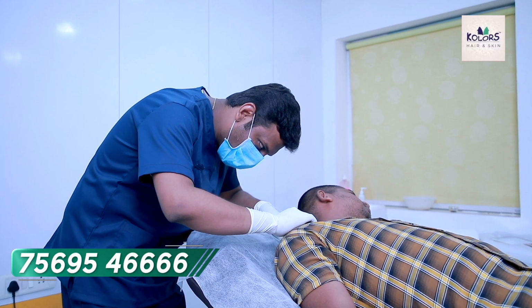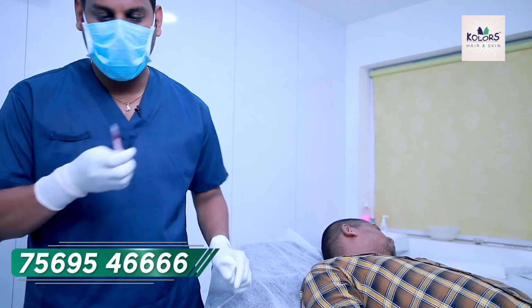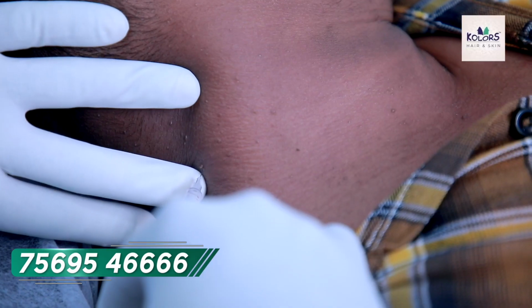Moving on to the procedure, first we will be giving the anesthesia, usually in the form of topical anesthesia or injection anesthesia. For topical, usually we will be applying a cream, that is 2.5% prilocaine and 2.5% lignocaine. Or for injection form, it will be 2% xylocaine, with or without adrenaline, depending upon the situation.